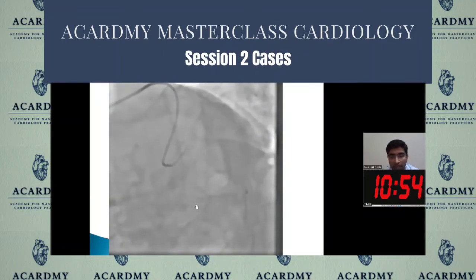So after looking at this angio, first we thought that it is a triple vessel disease. It is again a complex triple vessel disease because ostioproximal circumflex involvement is there. Right circulation is also not well maintained. So one option was to thrombolyse the patient. But with this coronary anatomy, we did not opt for thrombolysis, because we thought that if we restore TIMI 3 flow immediately in this vessel, it would be better for the patient as compared to taking the risk of thrombolysis.